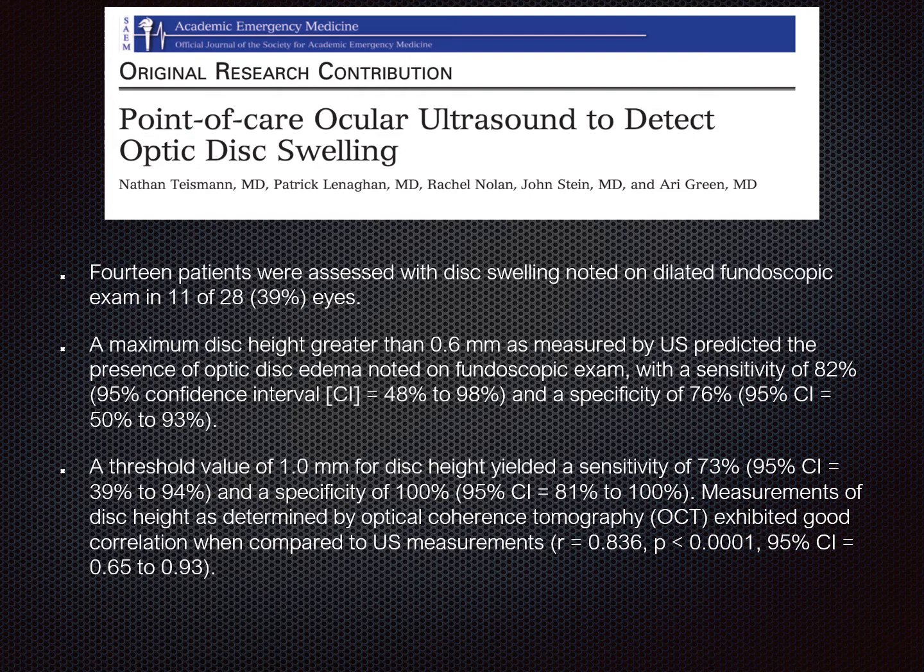So you're probably thinking, well, I'm very good at fundoscopy and finding papilledema, and why would I even need to use ultrasound for increased intracranial pressure? Remember, if you go back to the pathophysiology of why this measurement works, the increased intracranial pressure causing edema in the optic nerve, it would make sense that that edema would happen before you even saw papilledema, right? Because that edema has to travel down the length of the optic nerve as the pressure increases before the optic nerve can bulge at the disc and be visible as papilledema.